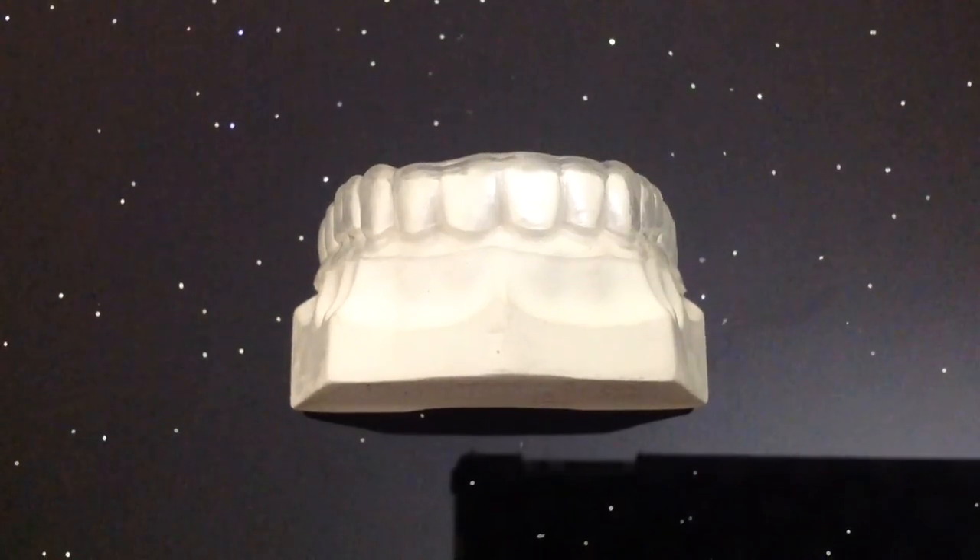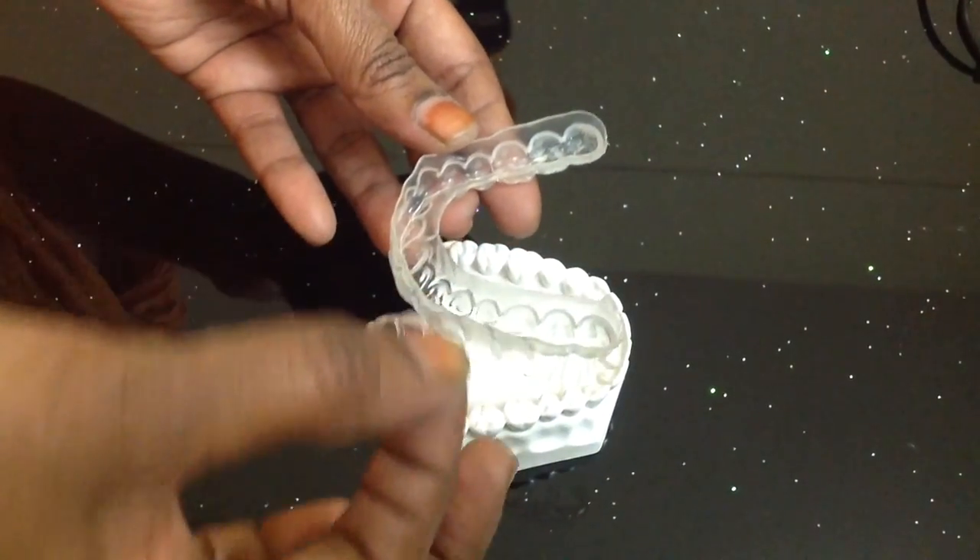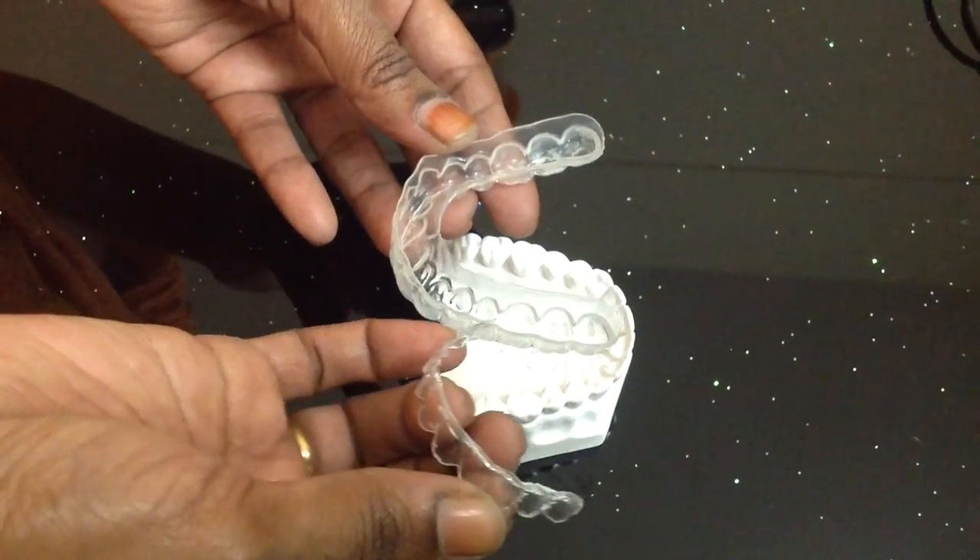The third and less used variety of bleaching tray is made by using the Durant Spacer. This is rarely preferred as it is double the cost of the previous two and takes the longest time to fabricate.